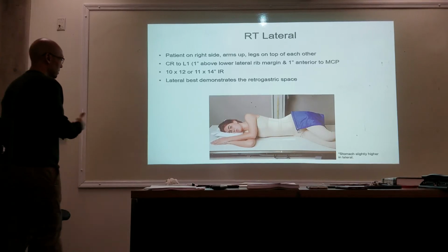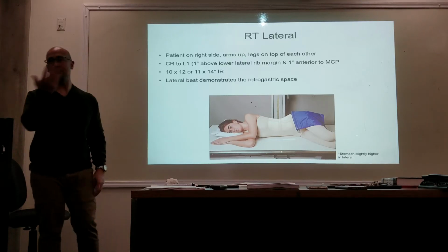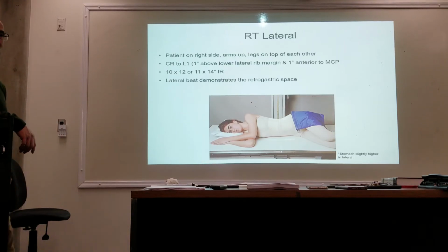And then, here's another test question. The lateral best demonstrates the area behind the stomach, the retrogastric space is well demonstrated in the lateral.